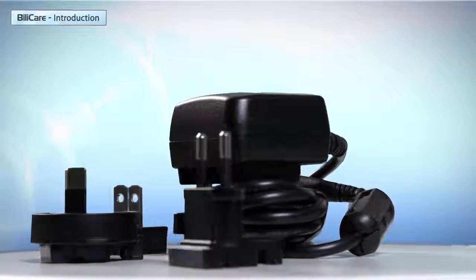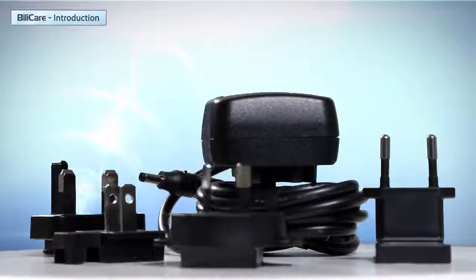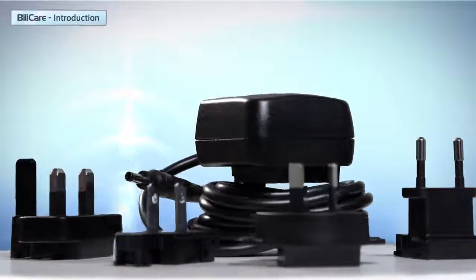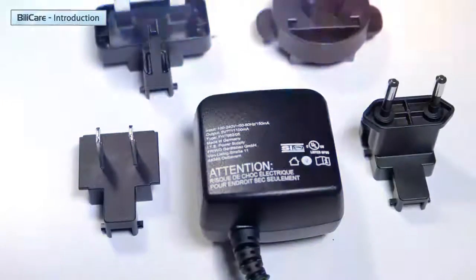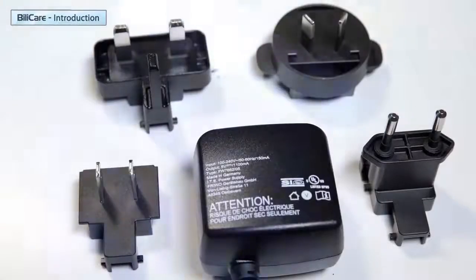The Bilicare power supply charges the handheld unit from any main source between 100 and 250 AC volts and between 50 and 60 hertz. Bilicare comes with a power supply and various connectors that fit different outlets around the world.